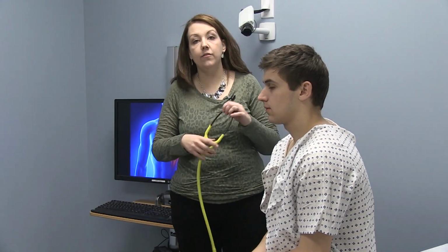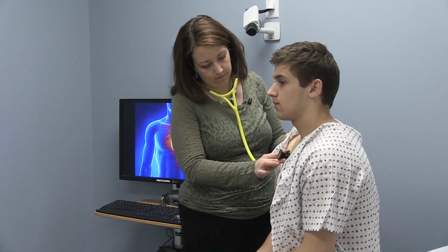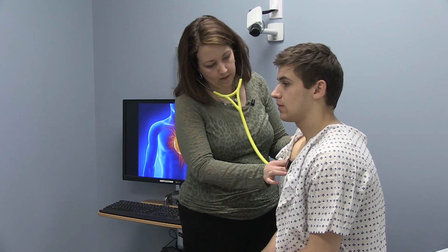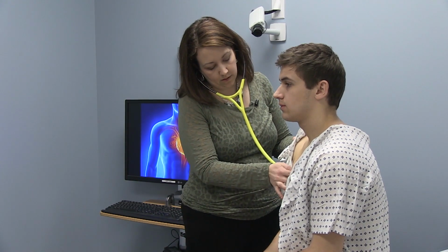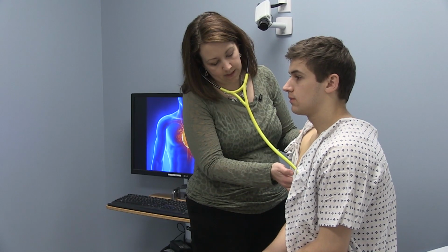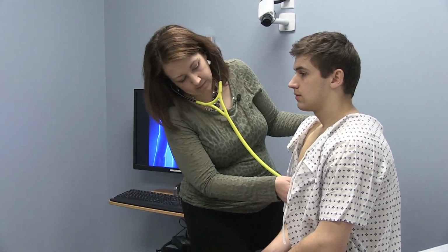So now we'll have our patient sit back up. We'll auscultate again with the patient sitting up because the heart sounds can be slightly different with the patient sitting up. So we'll listen in those same 5 regions again with the bell and the diaphragm. So aortic, pulmonic, Erb's point, tricuspid, and mitral.